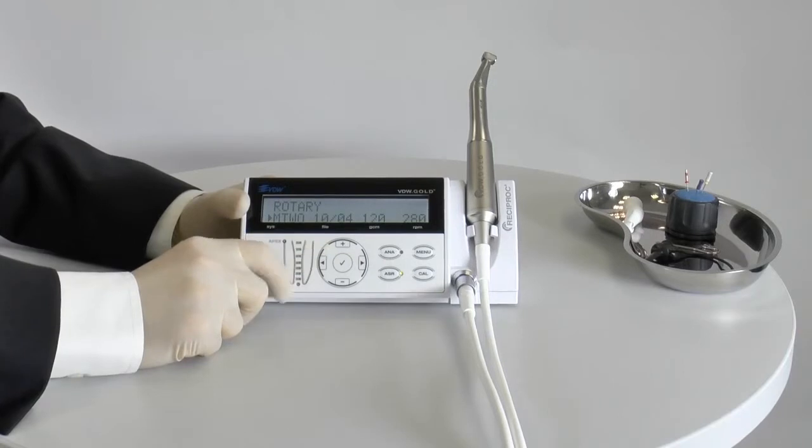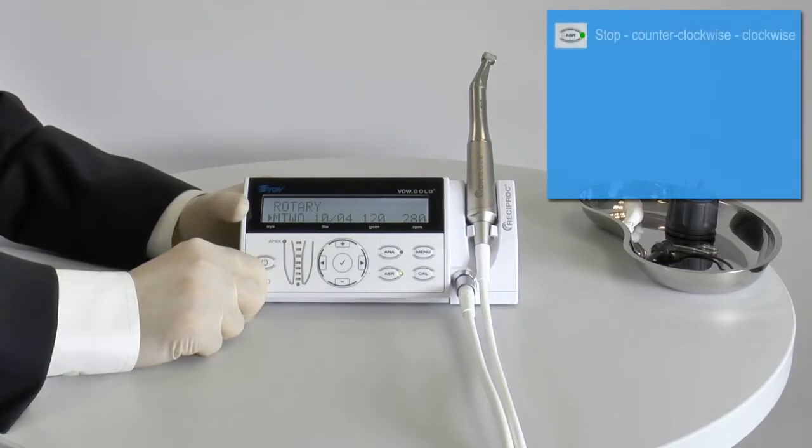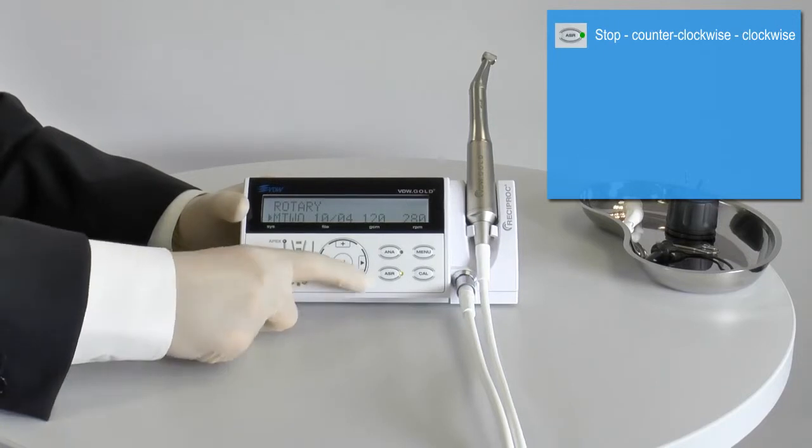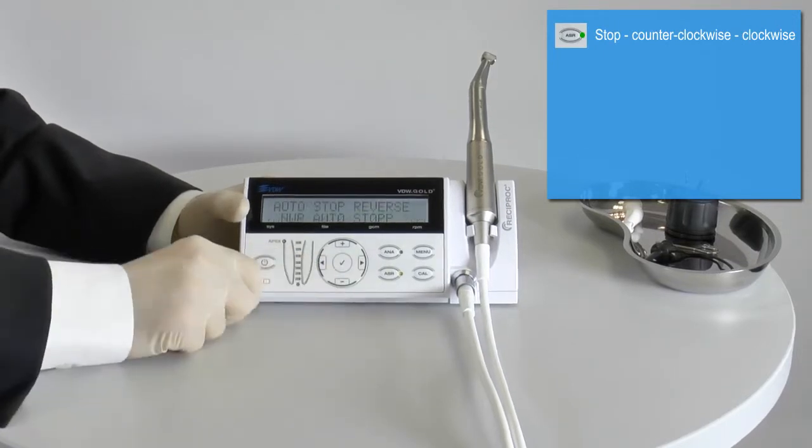When the preset torque limit is reached, the motor stops automatically and reverses into counter-clockwise direction until the file has freed itself. Then the motor will revert back to clockwise rotation.